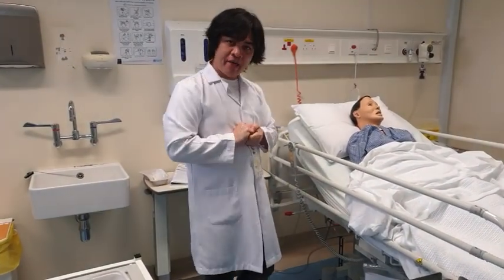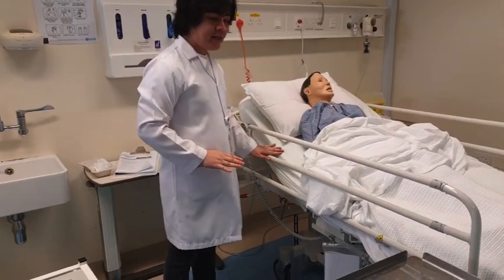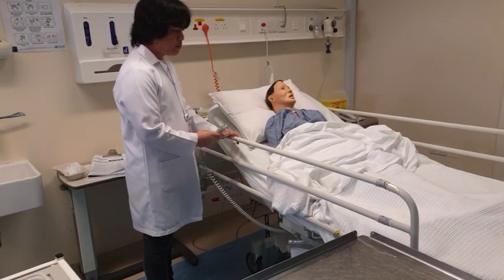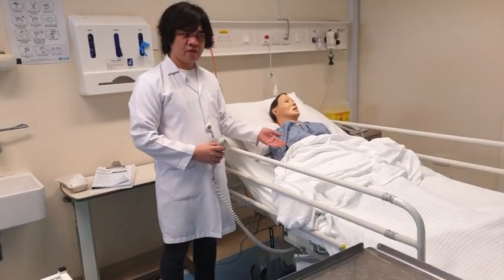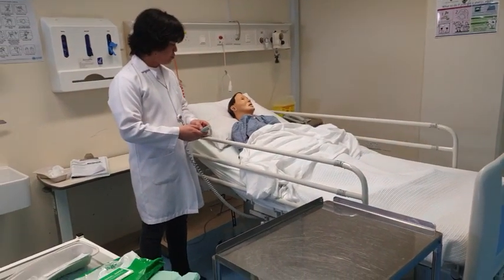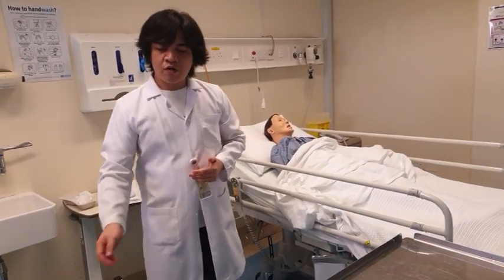At this point, we're going to prepare the patient and we're going to adjust the height of the bed. Of course, it should be within our working level. I think this bed is very high for me, so I'm going to put it a little lower. Or if you think that this position is comfortable for the patient, it's fine. Or if you want to put the patient in supine position, it's fine also. So at this point, we can start the procedure with our patient.